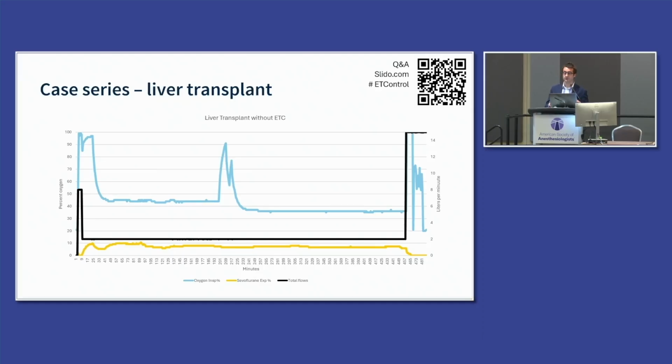That's because although we used to have piped nitrous oxide in our ORs, we didn't have piped air, which means that you have to have air tanks on the back of the machine. Which is why, when people asked whether, when we eliminated our nitrous pipeline, we'd be able to survive on nitrous tanks, we were able to say, well, we survived with air tanks for the last 30 years. And when they built the hospital, they put a nitrous pipeline in, but not an air pipeline, which is fascinating to me. And in 2025 is completely the wrong way around.